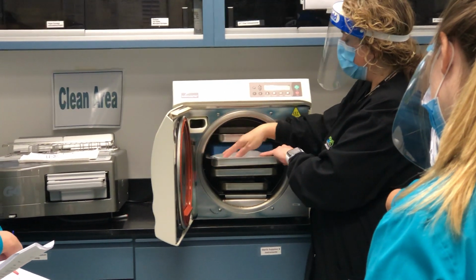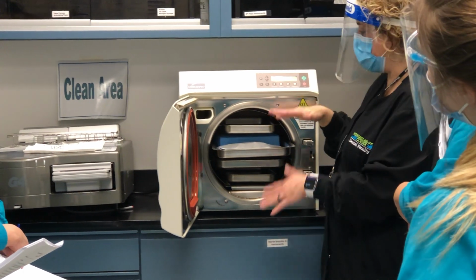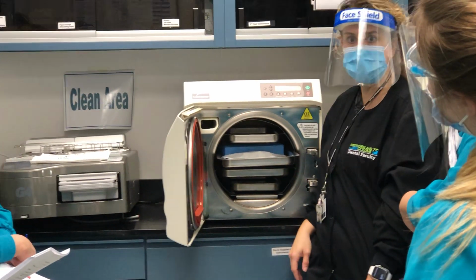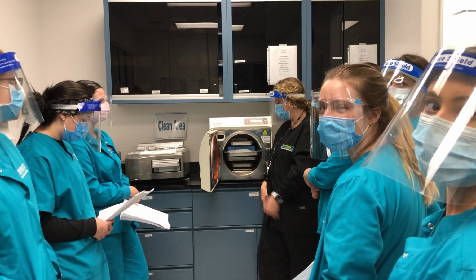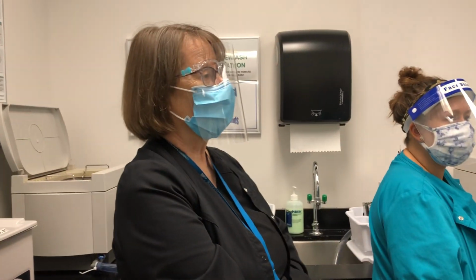And when you're loading an autoclave, the best thing to do is not to overload it and stack things on top of each other. It's best to have a nice flat layer of things so that you fit everything perfectly on one shelf. It's just like your dishwasher at home. You can make everything fit, but if it's overloaded, when you go to take it out, it hasn't been heated, and it's the same thing on the autoclave.